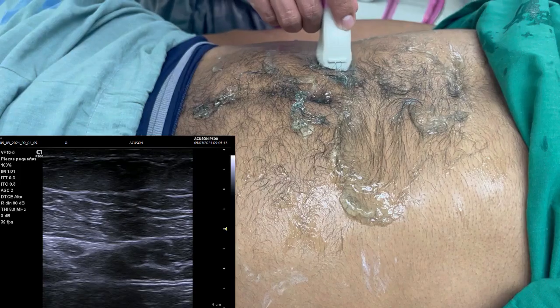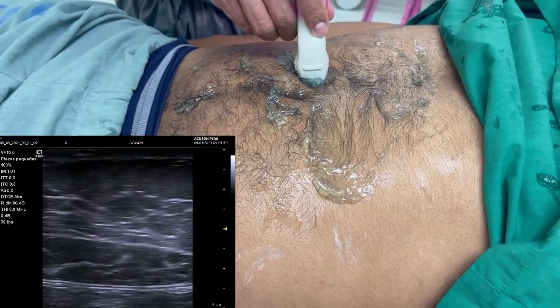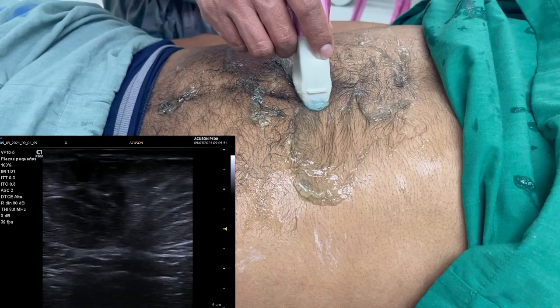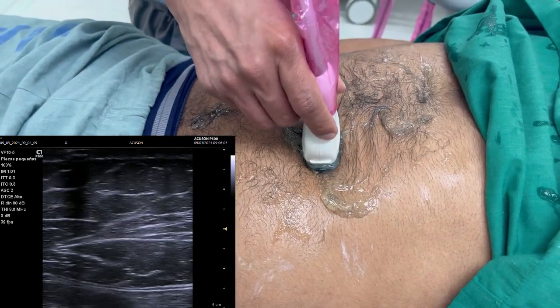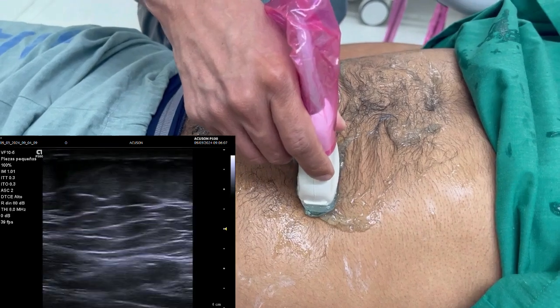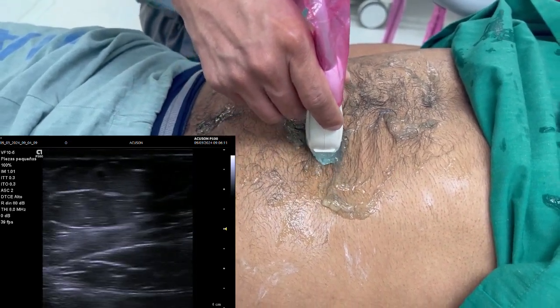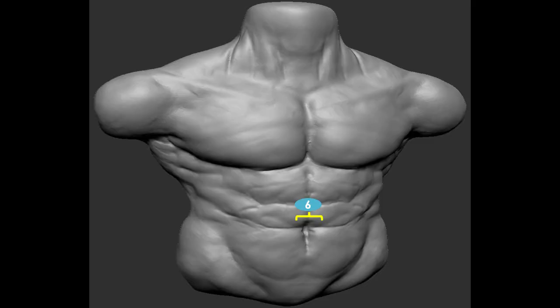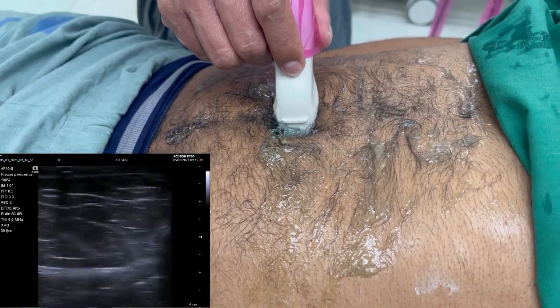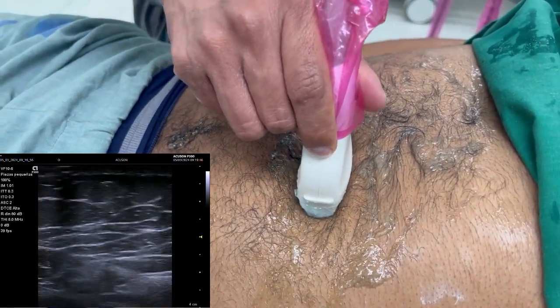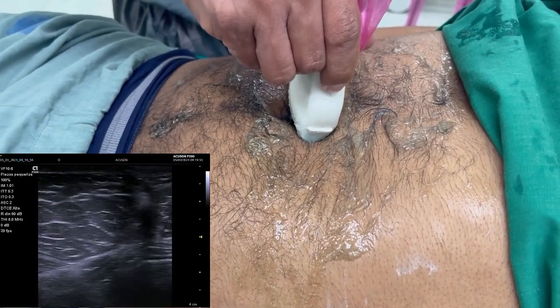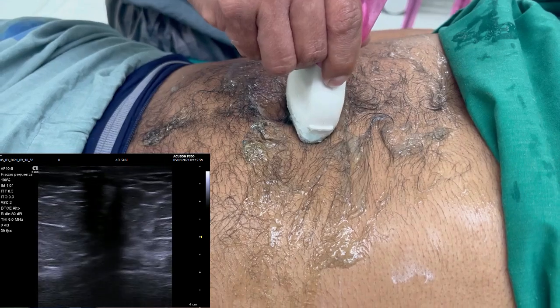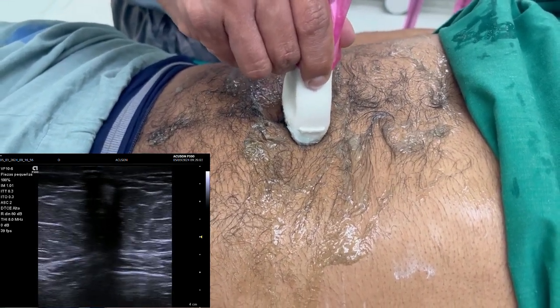In steps 4 and 5, we analyze the right rectus abdominal muscle at the umbilicus area and measure the width of these muscles at this level. We measure the right and left rectus abdominal muscle, trace the abdominal wall from the medial border of the right rectus abdominal muscle to the left rectus abdominal muscle, position ourselves at the umbilical scar performing maneuvers to rule out hernias, and also measure the midline to rule out rectus diastasis at this level.